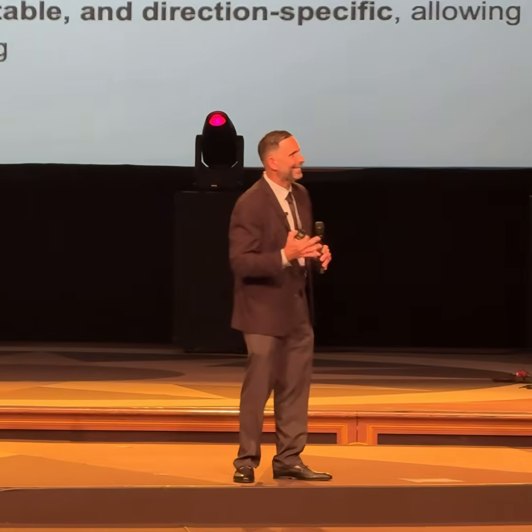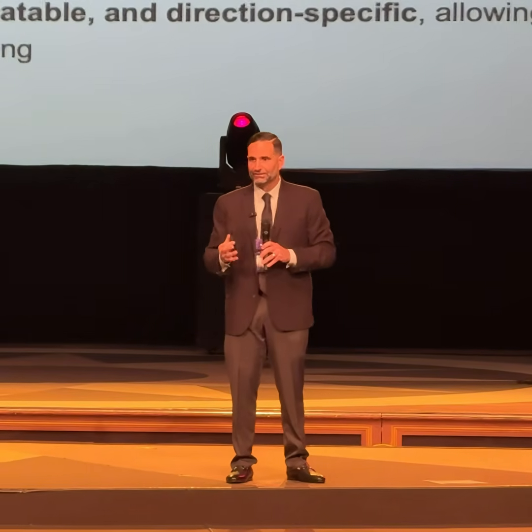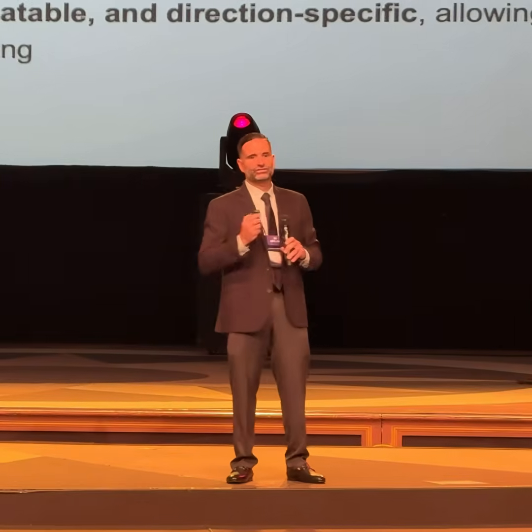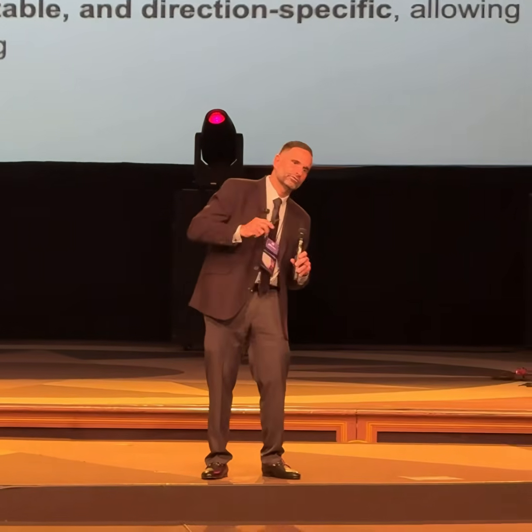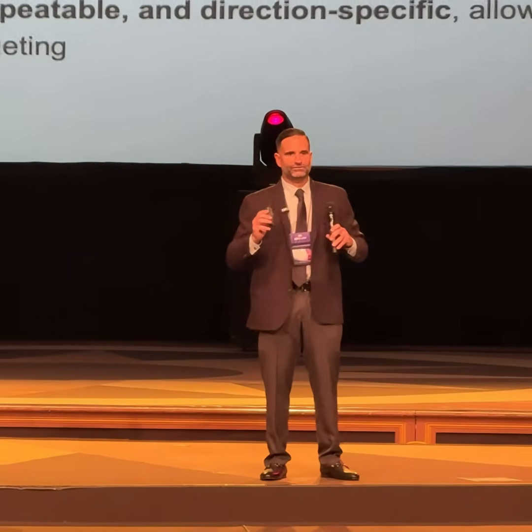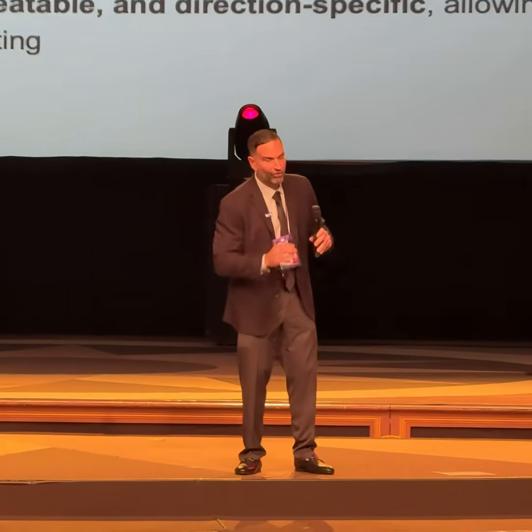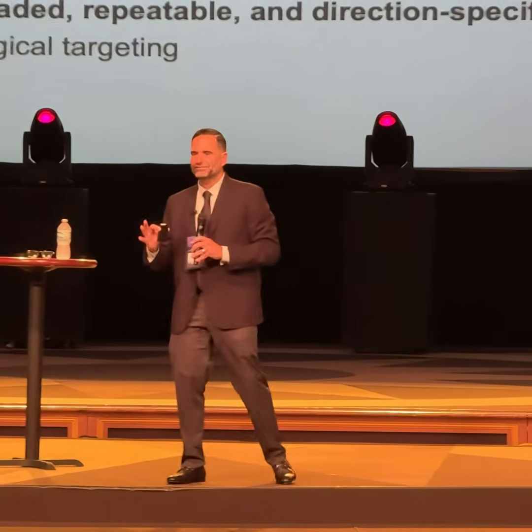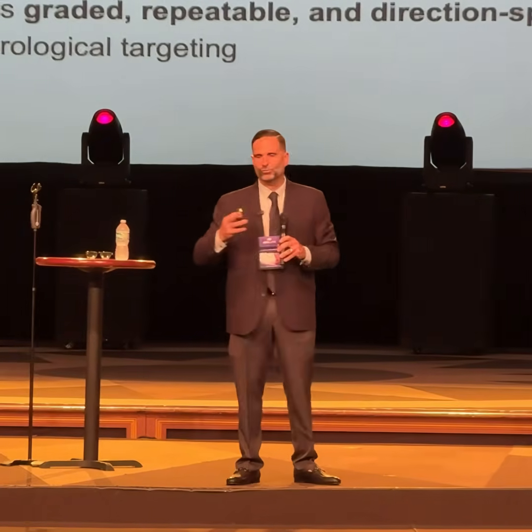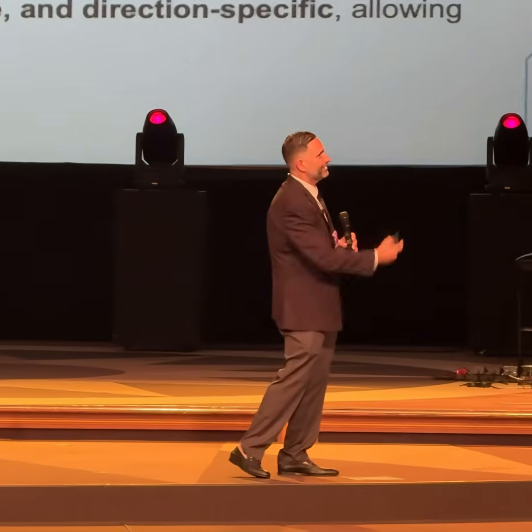But multi-axis movement allows movement in multiple planes. So not only just in rotation, but it allows in what we call roll, right? It allows us to have motion in pitch. It allows us to have motion in pitch and roll and yaw, all the different planes. The reason it's good is because the more planes we can access, the more robust the signal can be. Okay. So we're activating semicircular canals.